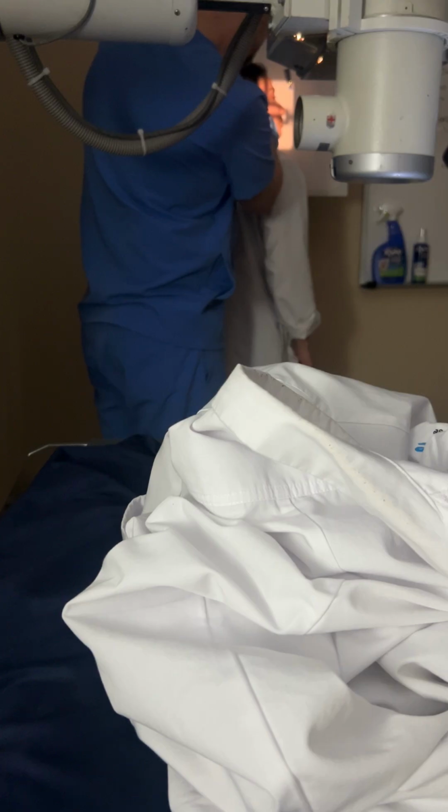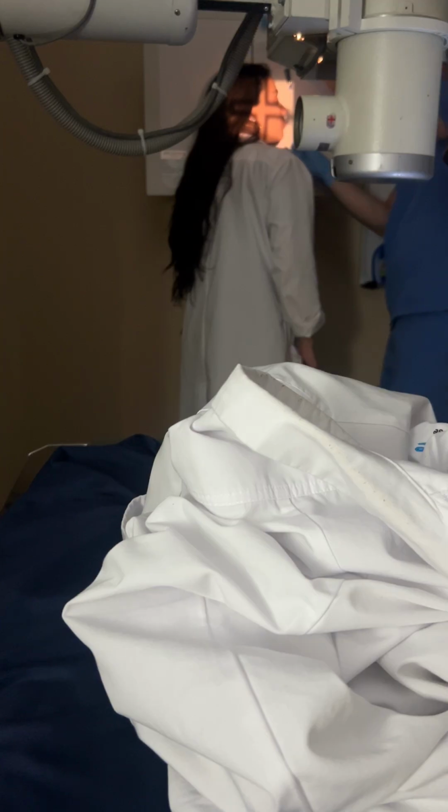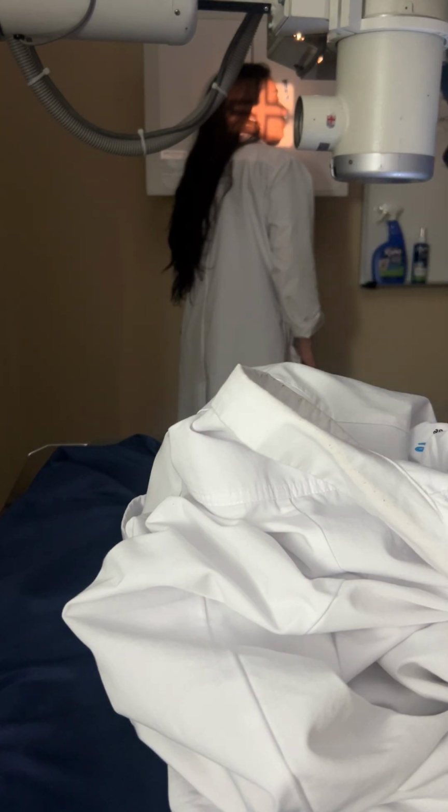So sorry, Nora. Okay? We're going to make sure she's not tilted. Great. And we are going to collimate down to just her facial bones. Where's the outer canthus at? Right there, where your eyelids meet. So between. Okay?